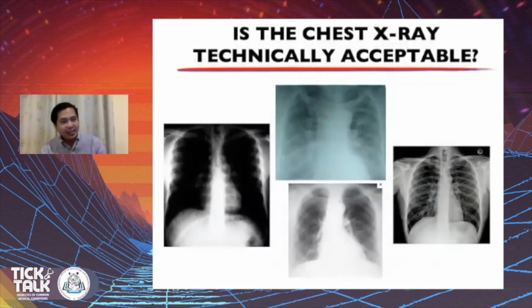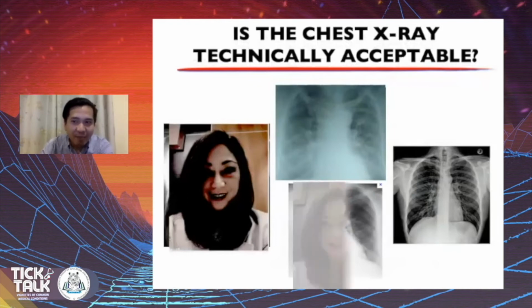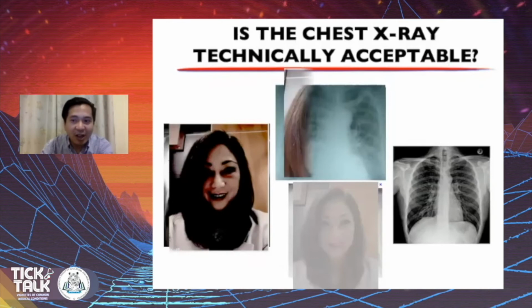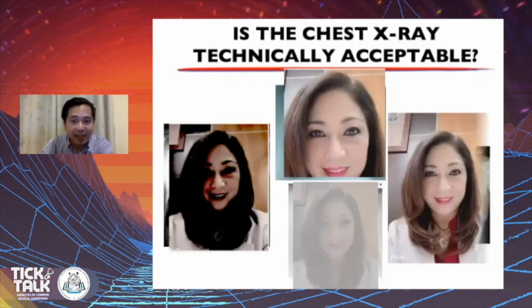Okay, chest X-ray is pretty much like submitting a passport picture. We certainly do not want to submit a picture that looks scary because it is not developed properly, or a picture that does not show the details, or one that is cropped and does not show the whole picture. We want what is complete, clear, and beautiful, of course, facing the front with clear details.